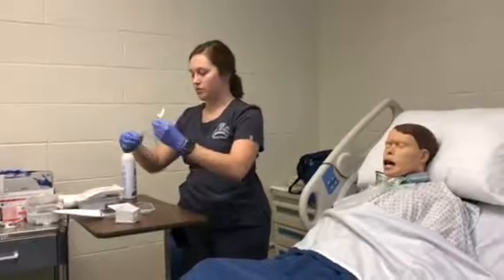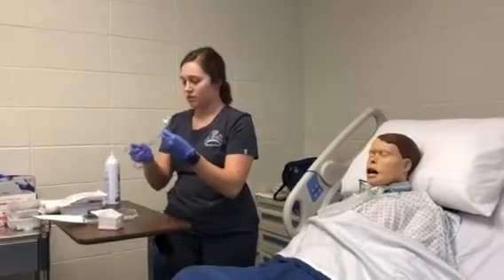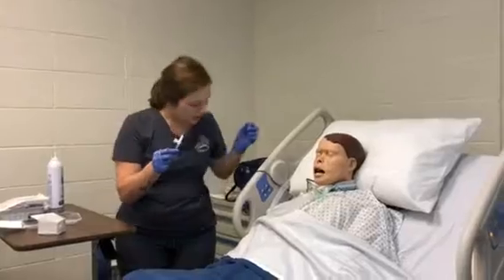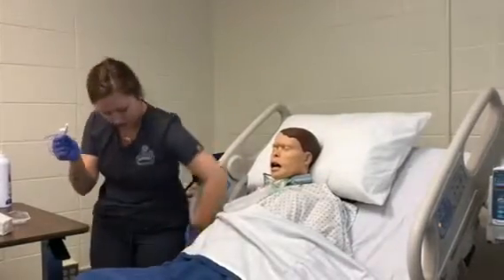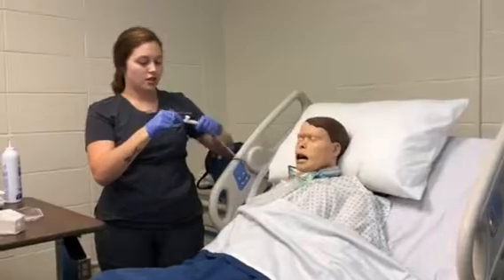Okay, so here's my suction. Just going to kind of wrap this around my hand. And this is going to be my non-sterile hand. Find the end of my suction tubing and connect that. Make sure it's got a good tight seal.